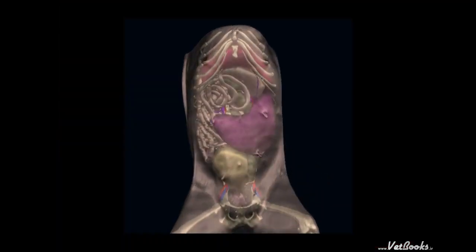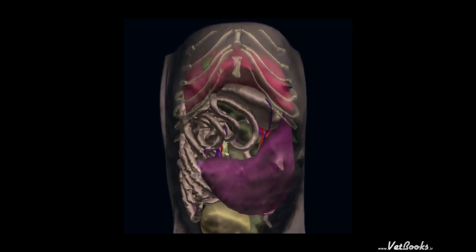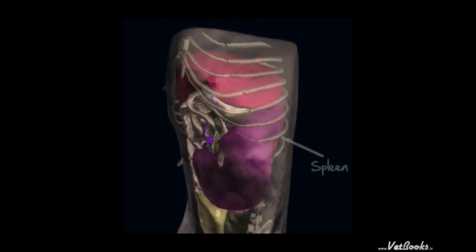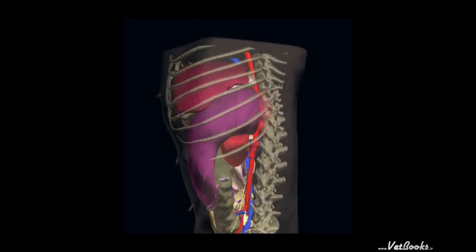The liver is located under the costal arch between the diaphragm and the caudolateral portion of the lungs and the stomach. The combination of acoustic shadowing artifacts and reverberation caused by these different structures can sometimes limit our ultrasound access. The head of the spleen is close to the liver on the left side. This proximity sometimes enables us to compare respective echogenicity on the same image.